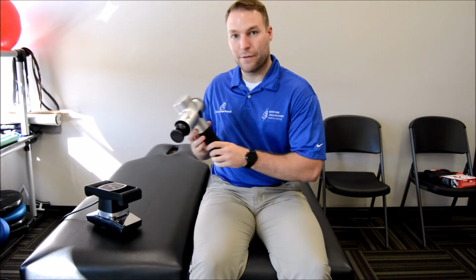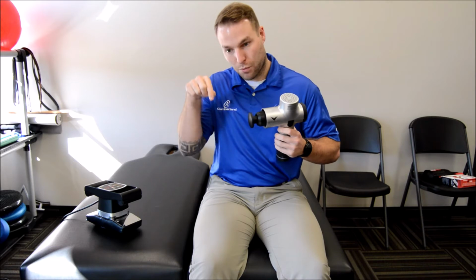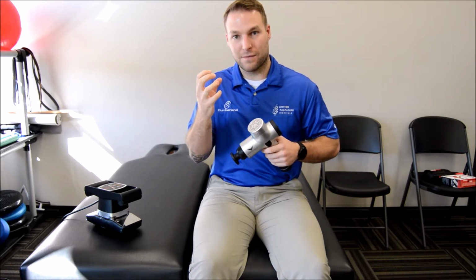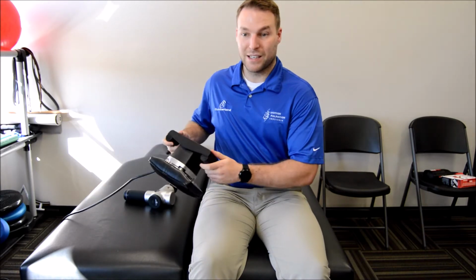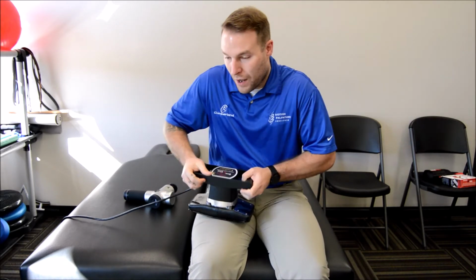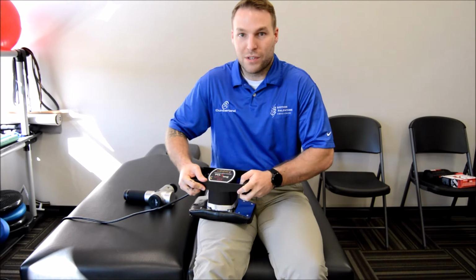The same thing can be said for our percussion massage tools. The difference with these is instead of shaking side to side, this little plunger pushes down into the muscle, and what that's going to do is it pushes a little stretch on that muscle and causes the muscle to contract and relax very quickly, and that repetitive contract and relax thing makes the muscle kind of calm down a little bit. What I like to do personally with these things is I like to do what I call dynamic vibration or dynamic percussion massage. So I'll turn this on, I'll put this on a tight muscle, and while I'm kind of pulling one way, I like to contract the muscle and move tissues in different directions so we get this kind of tissue sliding effect.